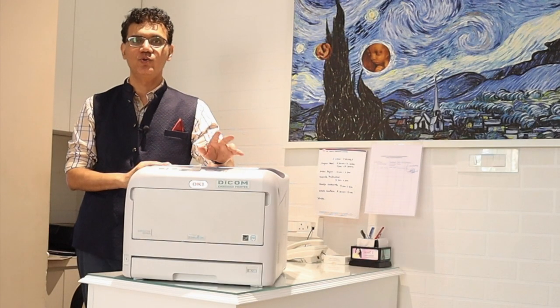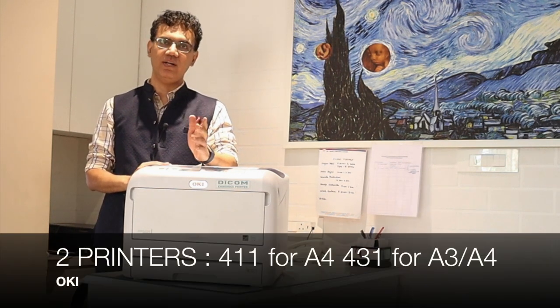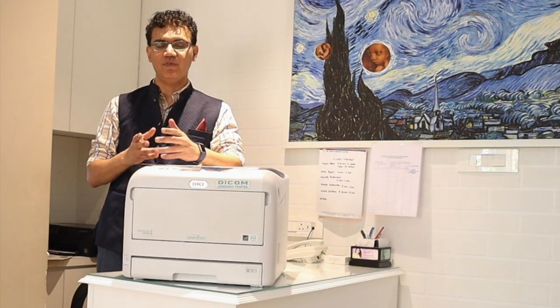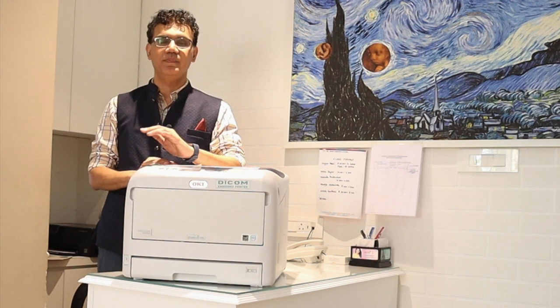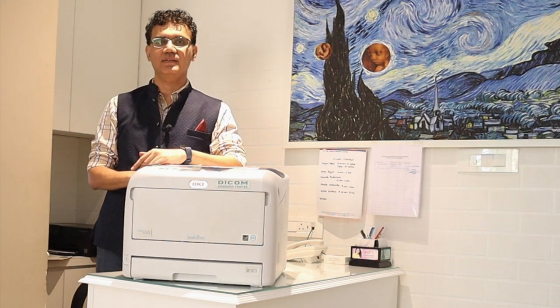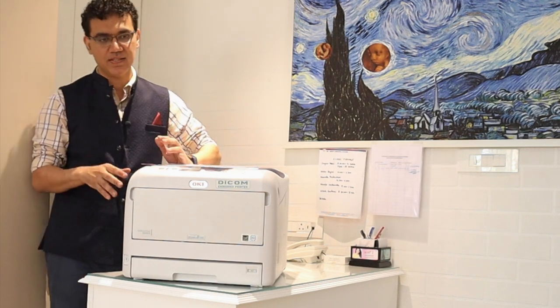SS Digitech has two printers — one is for A4 paper, which is classically for ultrasound users, but there is another amazing new printer that we are going to review today. This one can take all prints, be it CT, MR, and ultrasound, handling all sizes right from A4 to A3.